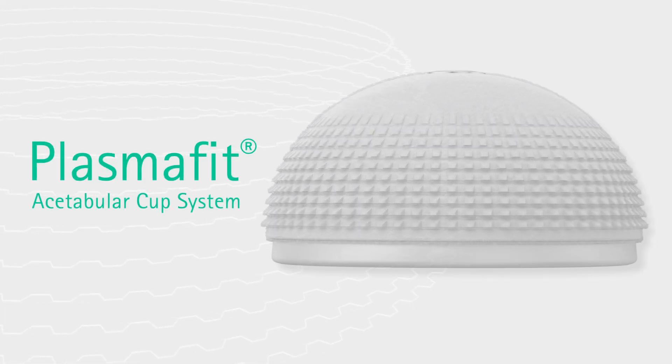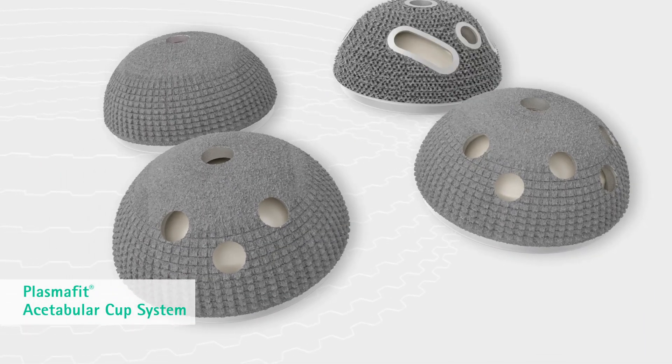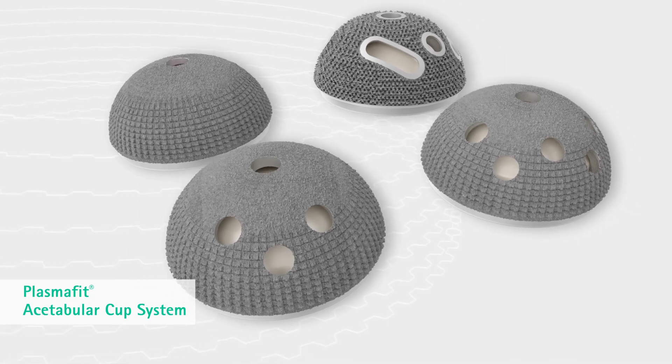PlasmaFit Acetabular Cup System. The Esculap PlasmaFit family reflects a comprehensive solution for total hip joint replacement: poly, plus and revision.